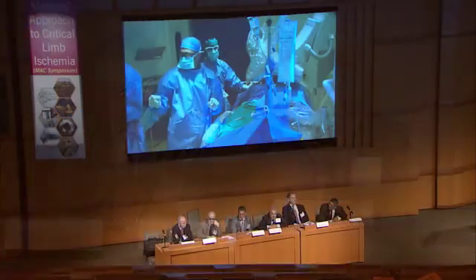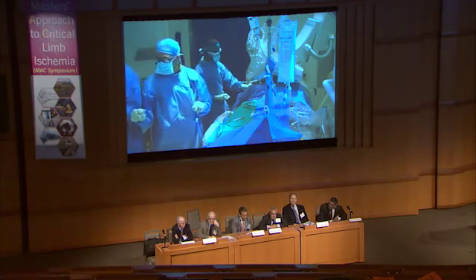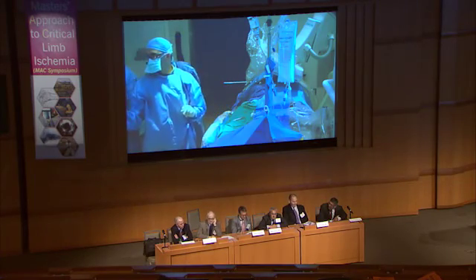Thomas? Yeah, definitely, because there are two branches which are providing the AV fistula. So this is the area which I would have covered initially with the wire band, to be honest. John? Well, with all respect to my colleague, Dr. Manzi, I would put in the stent. I would put in the covered stent here.